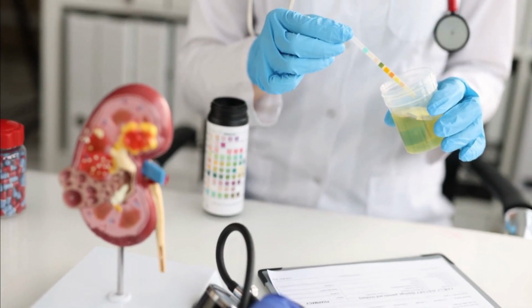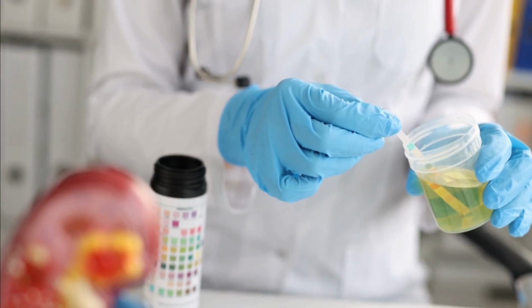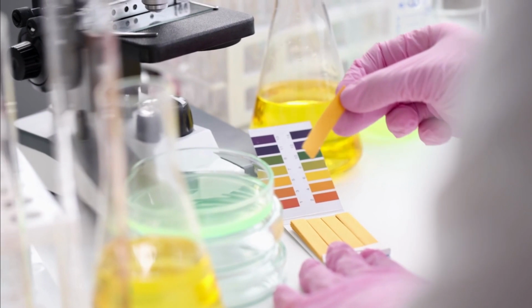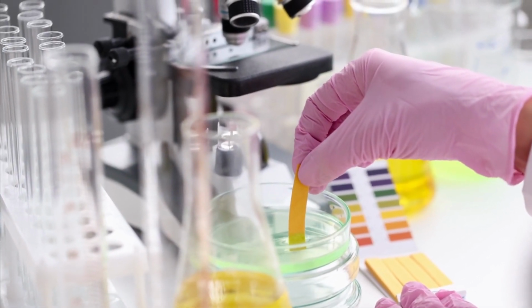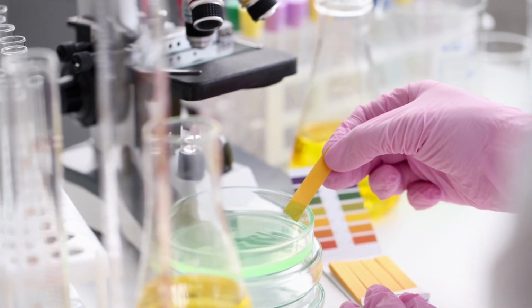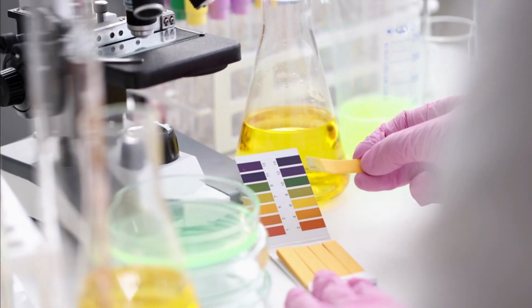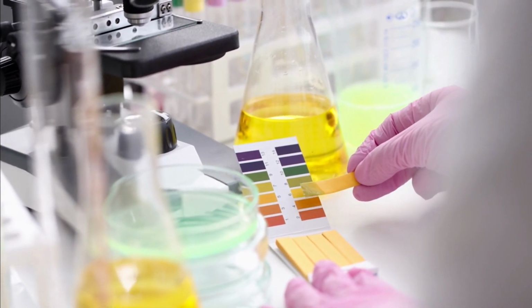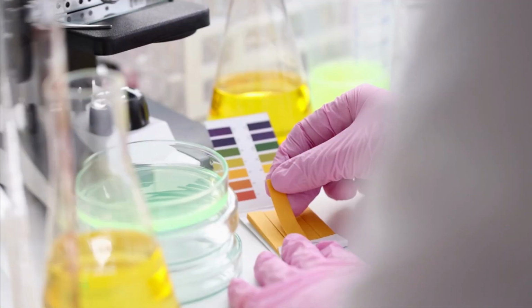Next, we delve into the chemical examination of urine, which gives the provider even more insight into a patient's health. The pH level of urine is an important piece of the analysis. The pH scale ranges from acidic to alkaline. In general, an acidic pH is less than 7 and an alkaline pH is higher than 7. 7 is considered a neutral pH. In a healthy person, the urine is slightly acidic, with a pH of 5 to 6.